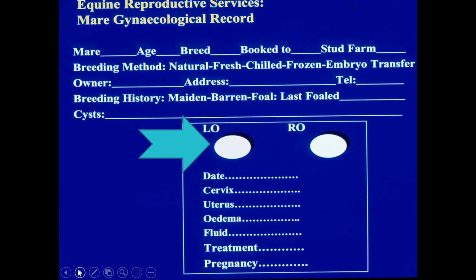You can see the left ovary and the right ovary as silhouette diagrams. What we actually do is, with our pen, or if someone's assisting us making the notes, they'll do it, we write on there important structures. Now, you may think, and in fact the title of this presentation may lead you to think, the only important structure to record in the ovary is the follicle.